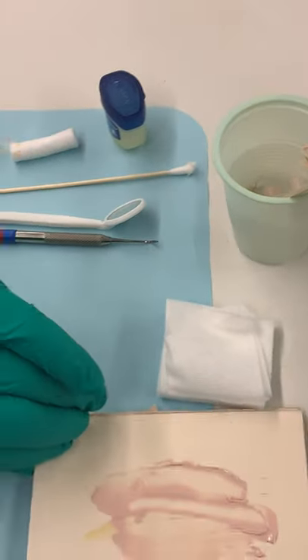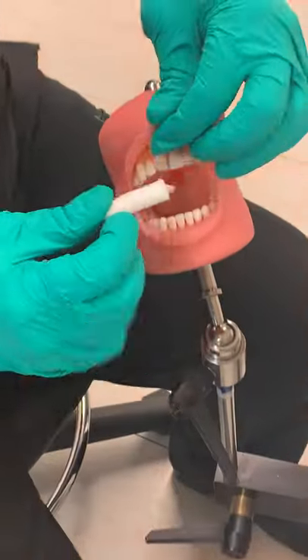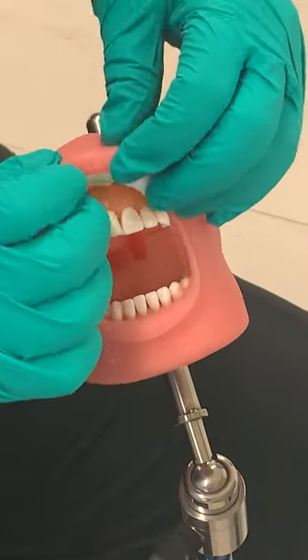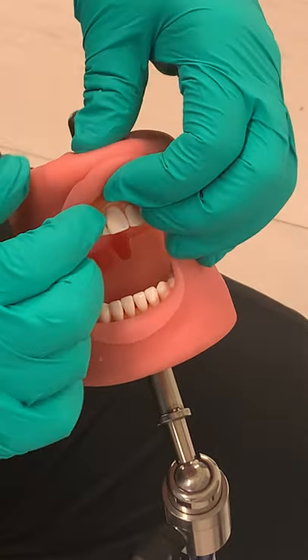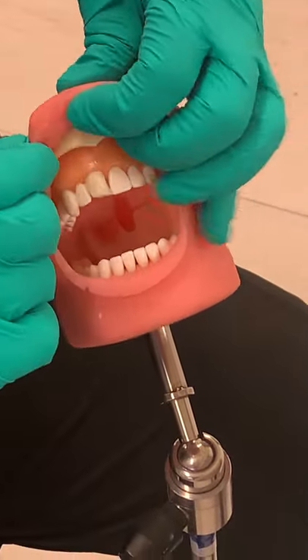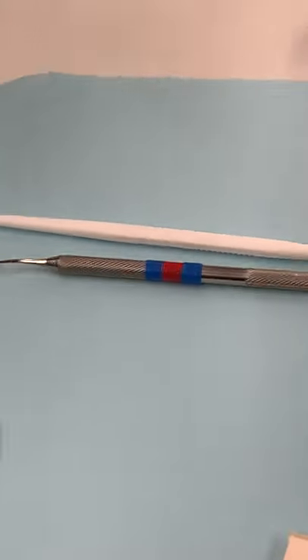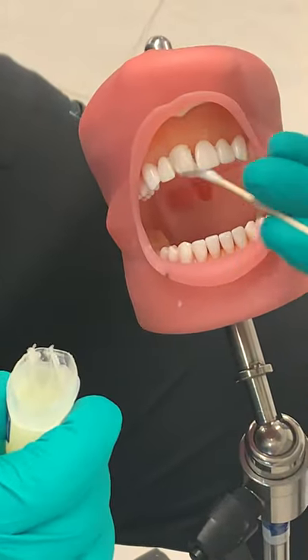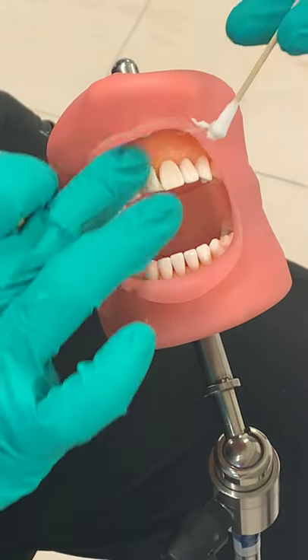While that's setting up in the water, I'm going to get my patient ready. I'm going to put a cotton roll up here so I can retract that lip. And on your typodont we're going to put vaseline — this would not be for a patient because the vaseline would make it not stick, but for your practice purposes to help with cleanup, we'll put the vaseline on there.